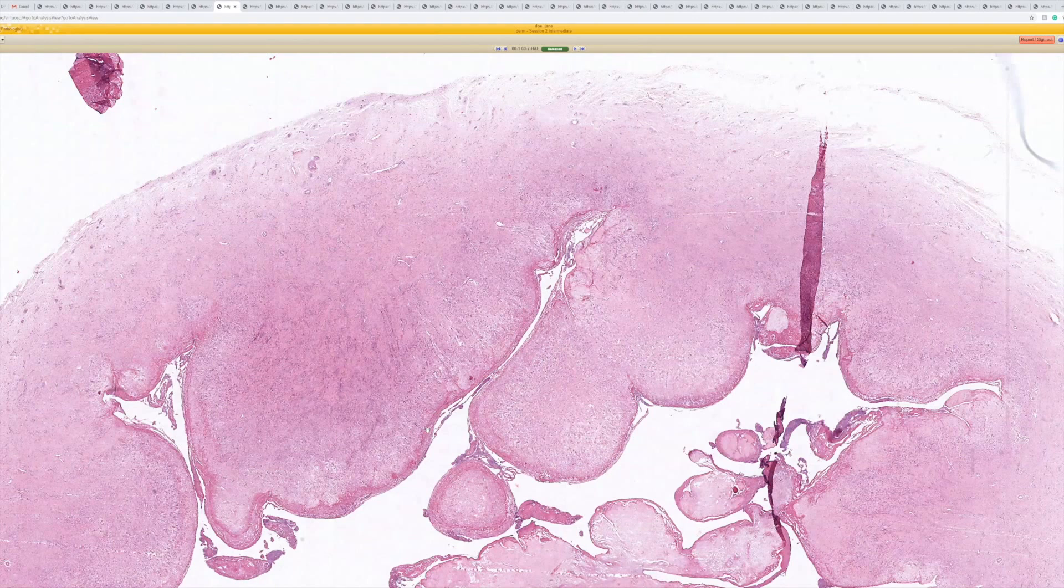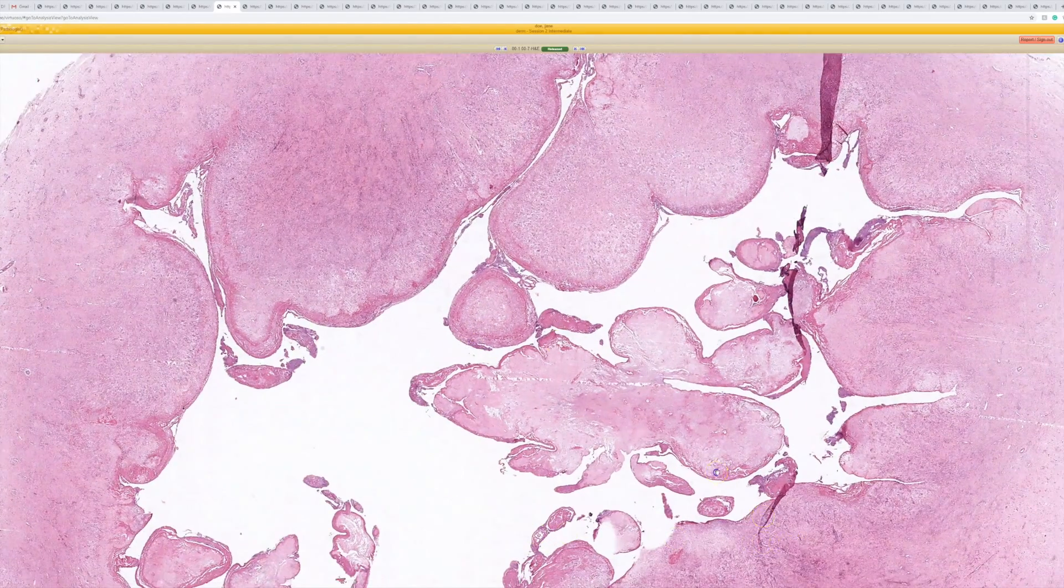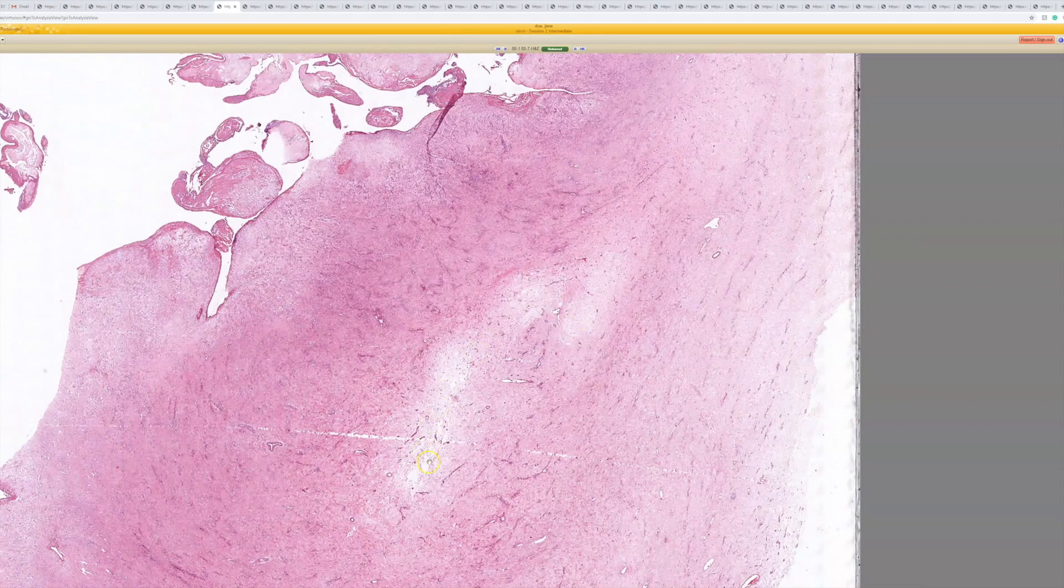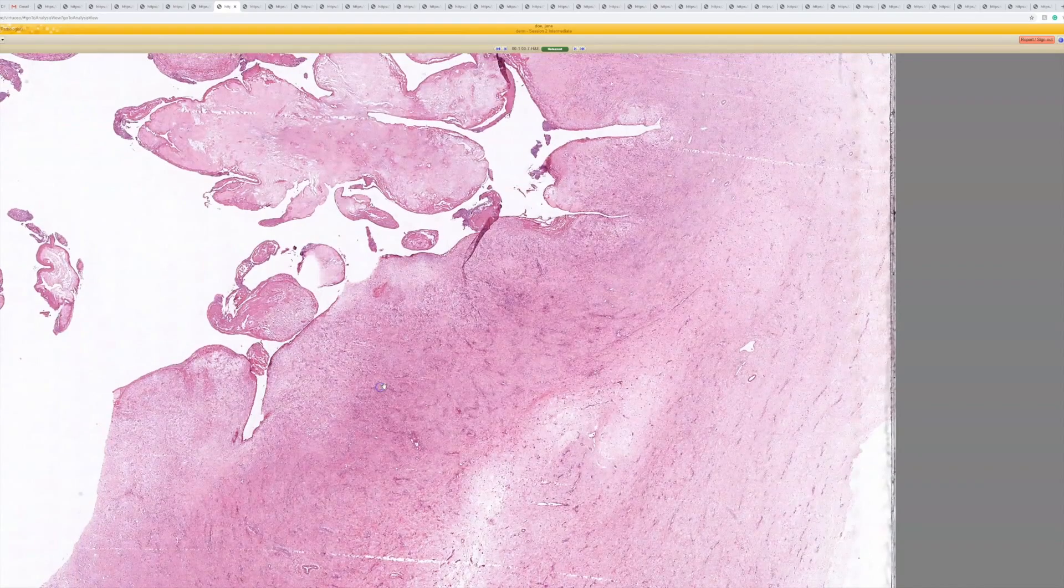But a lot of times that's totally washed out like is the case here, all washed out during processing. Sometimes that can leak into the surrounding tissue and give you zones that look kind of myxoid or loose and mucinous. It just varies from case to case.